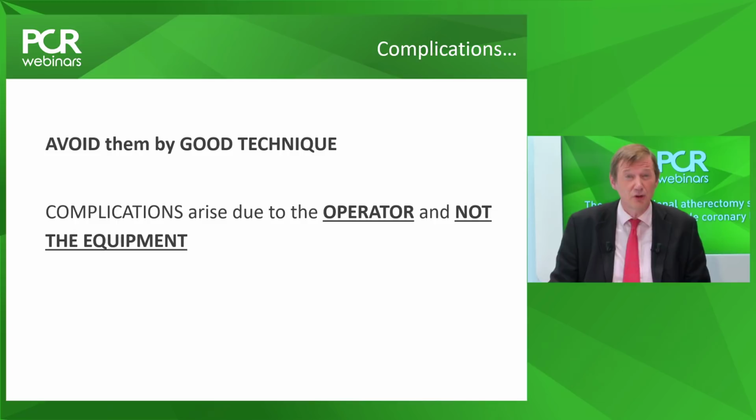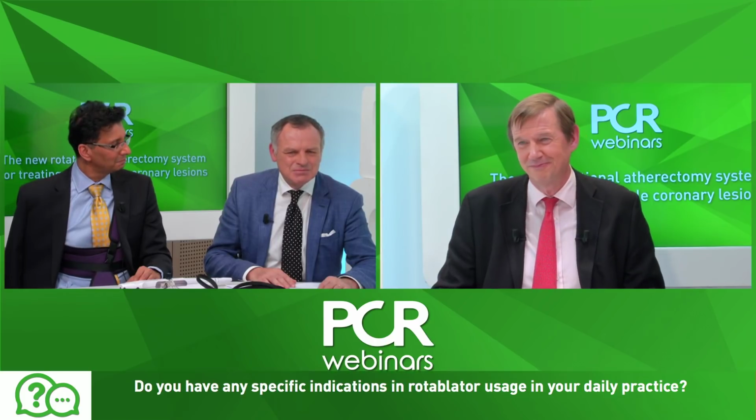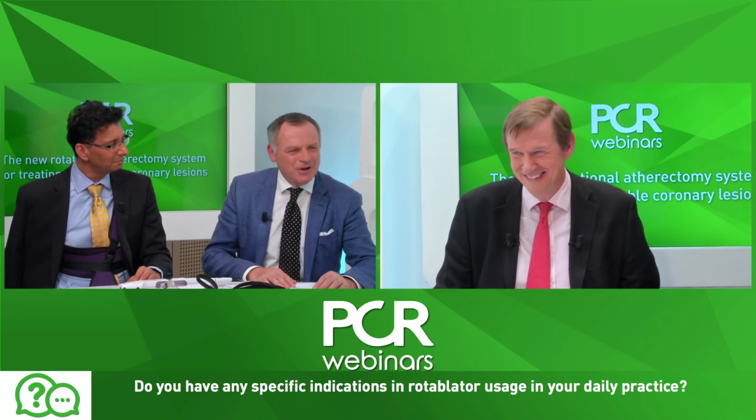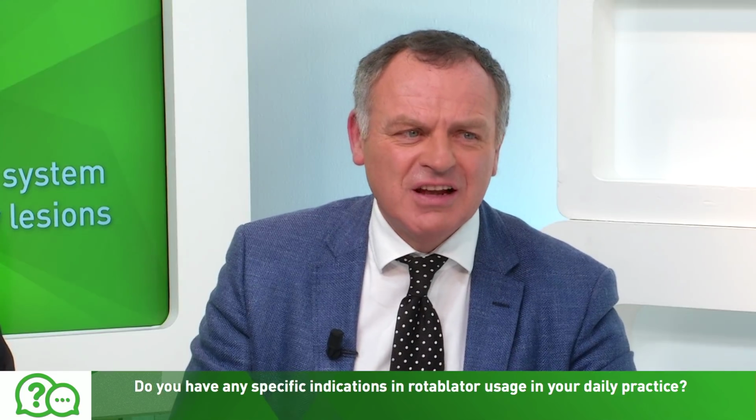Just some final questions from the floor. Do you have any specific indications for rotational atherectomy, just briefly, Bruno, that we haven't covered? Obviously, it's been very focused on undilatable calcified lesions. Are there any niche things that you use it for in your daily practice? I don't remember other techniques. Usually for calcified lesions, I would say. More and more I use it up front before any difficulty. So I would say that the main indication is calcified lesion.